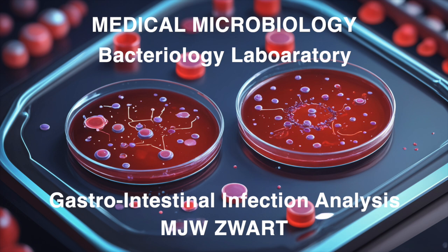We need to confirm our suspicions. So we run the GE-PCR panel. We're checking for the usual bacterial culprits. Okay. But while we're waiting for those results, we can start thinking about other cultures based on this specific patient. Ah, you mean like using that personalized roadmap we were talking about? Exactly. In this case, because they were traveling and have watery diarrhea, we might want a culture for Vibrio species, even if the PCR comes back negative. So we're being extra thorough.